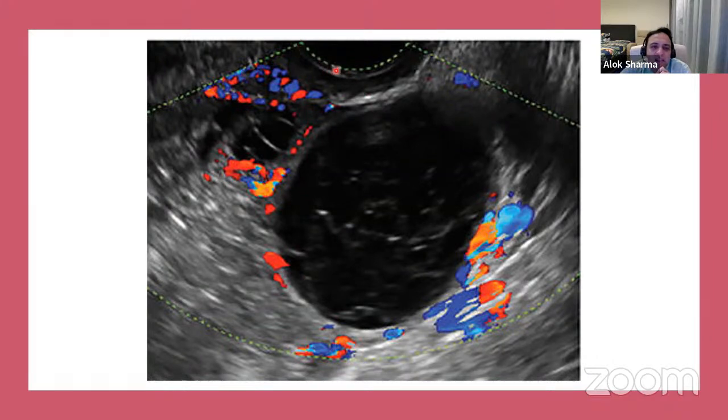So if you look at this, this is a sector probe. The sector probe is going to give ultrasound waves in all these directions. Now, clearly, this is the nearest area. It's also an area of increased density where there's a large difference between the acoustic impedance of the fluid or the gel that's allowing these probes to come in, which is causing reflectivity. And that reflection going back is producing a bright area over here.